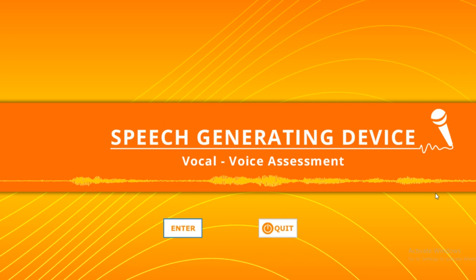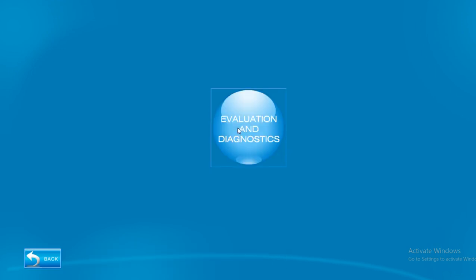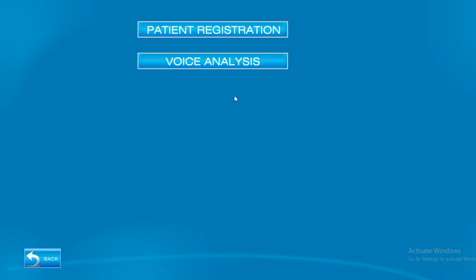parameters in it, like your complete database to be incorporated over here. So you have the whole history of the patient and a vocal assessment taking place. The vocal assessment goes on for about 5 seconds basically. Just a 5-second recording, even a minimum of 4-second recording will definitely help to get the voice analysis, and we get about 26 parameters. Now you watch the screen how it happens.